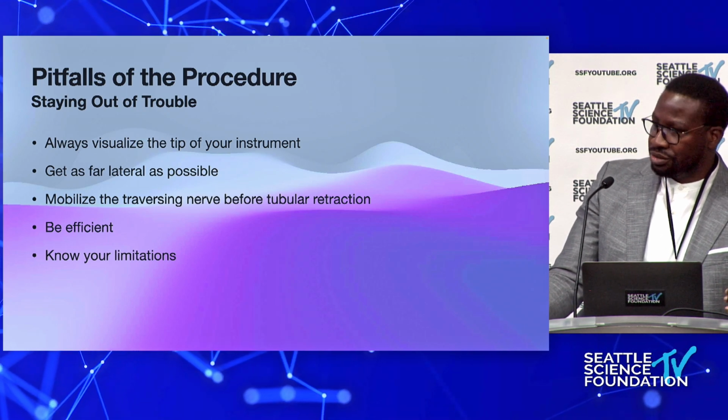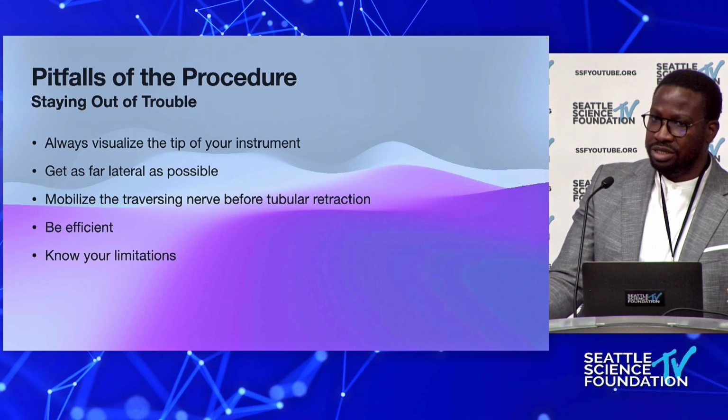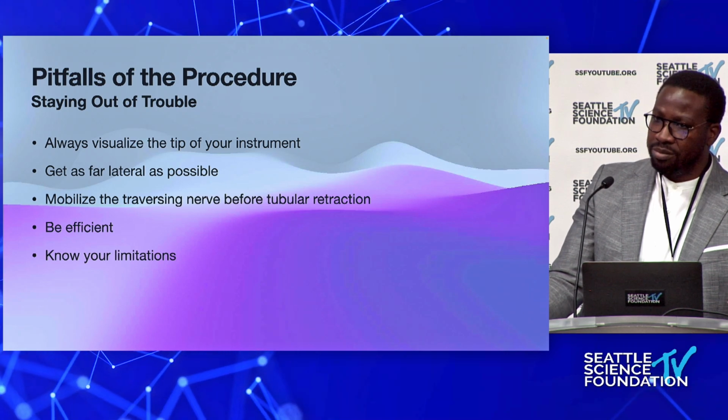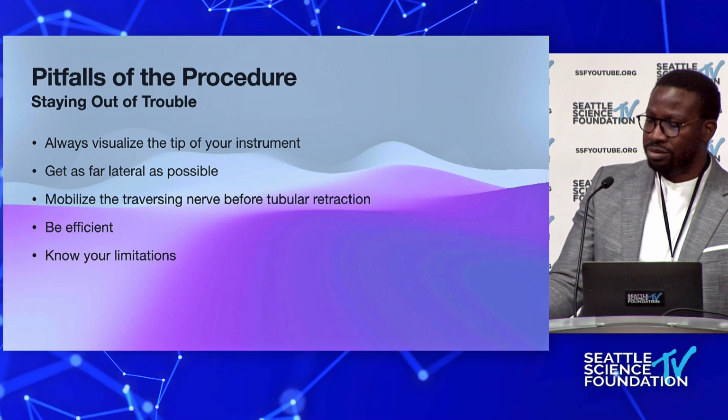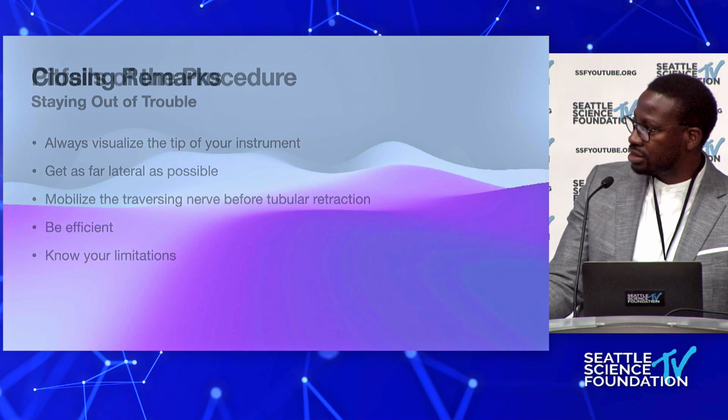But you can see that surgery is not about being fast, it's about being efficient. And if you're constantly practicing these routines and doing the same techniques over and over and focusing on being efficient in surgery, your operative times will get better, as Christoph showed with his presentation in the last slide.